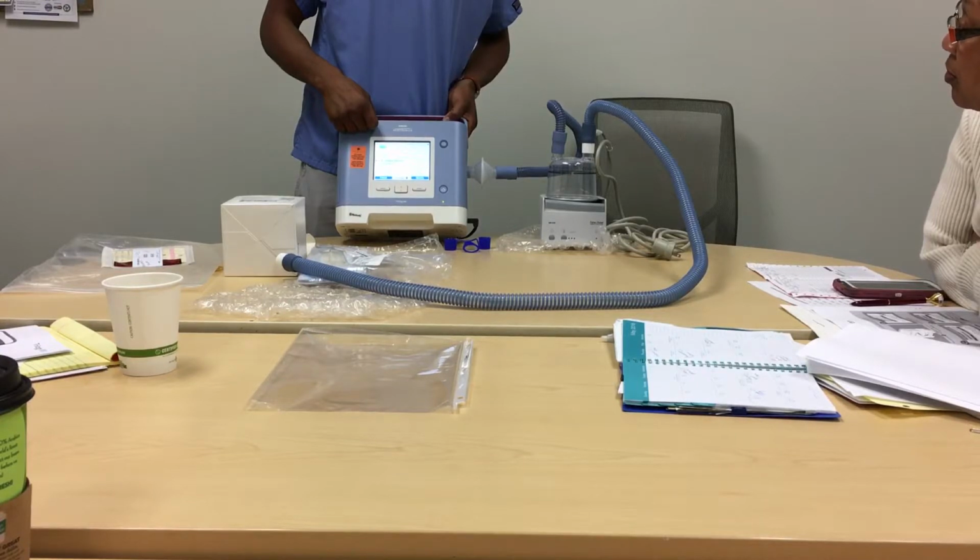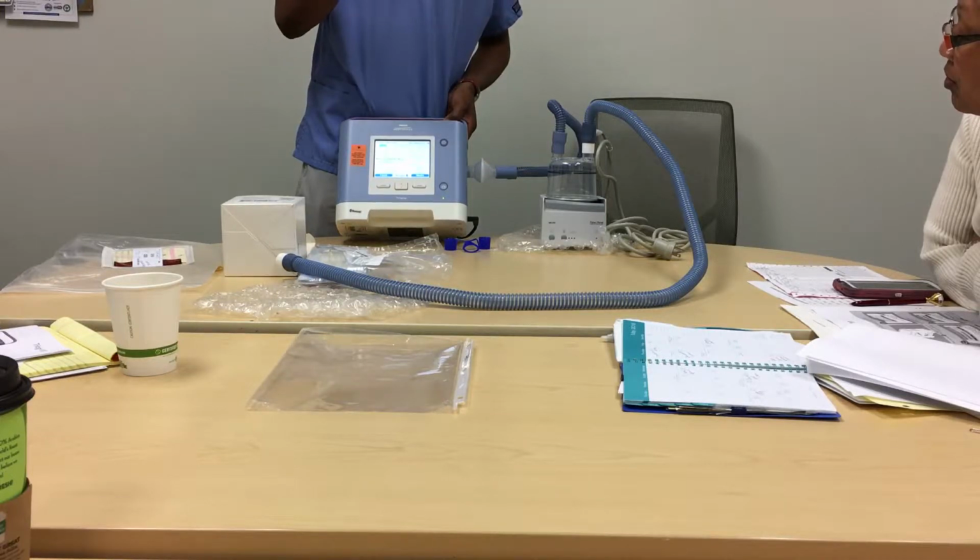And institutions like UCSF modify the flow trigger now to auto-track. It is a lot more sensitive for them.